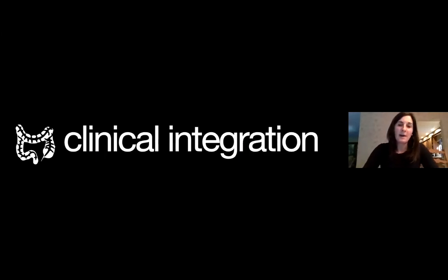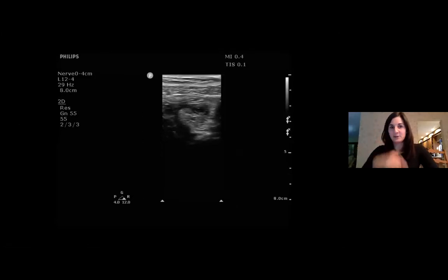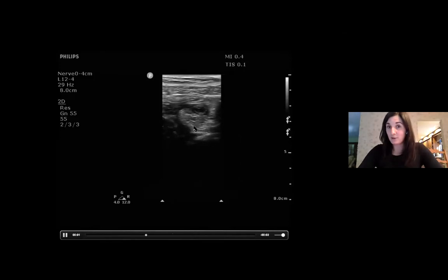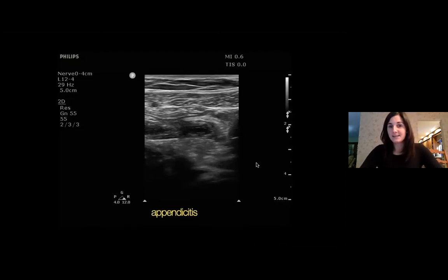So you're working an emergency shift and then you have someone coming in with right lower quadrant pain. You put your probe at the X area of maximal tenderness. And what do we see here? That's actually quite easy because I showed that picture a few times. So it looks like an appendix, an inflamed appendix. And you think it's appendicitis. You stop, you do your measurement. It looks angry. It's non-compressible, blind pouch, no peristalsis, definitely more than 6 millimeter. You're done. This is appendicitis.